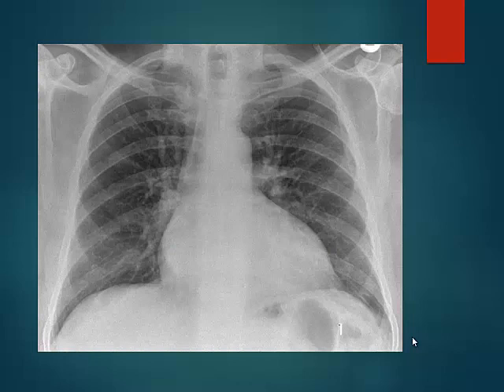Looking at the pulmonary vessels, what are these? We're looking at upper lobe vascular redistribution, or upper lobe diversion. Are they arteries or veins? They're veins, yes. So why are the veins distended? What does it mean? There's increased pressure in the left atrium. What's the normal pressure in the left atrium? Less than 10? Yeah, less than 12. Up to 12 is the normal pressure in the left atrium.